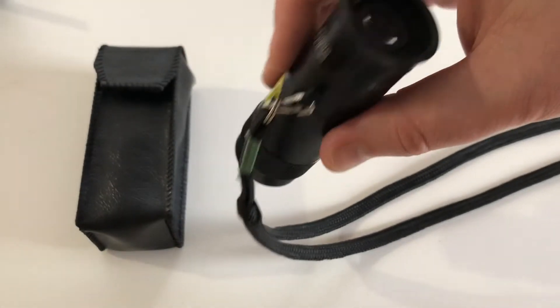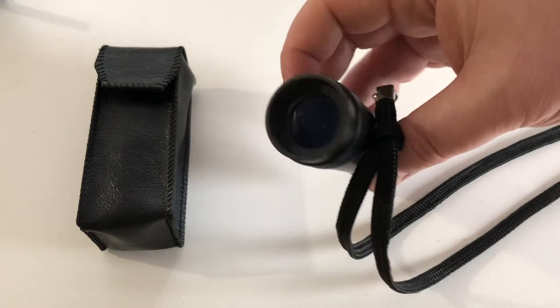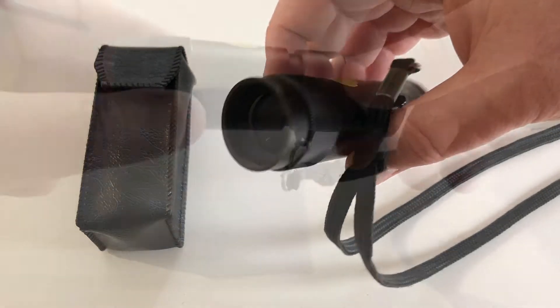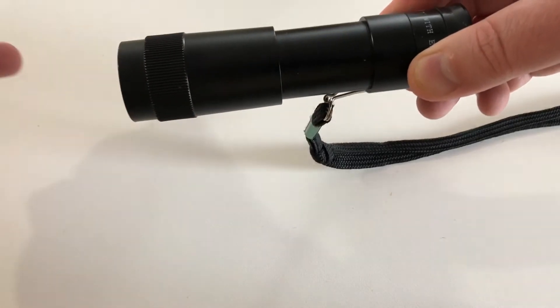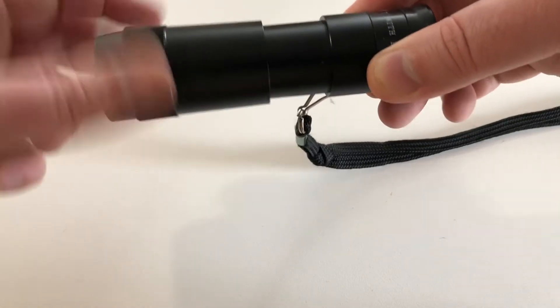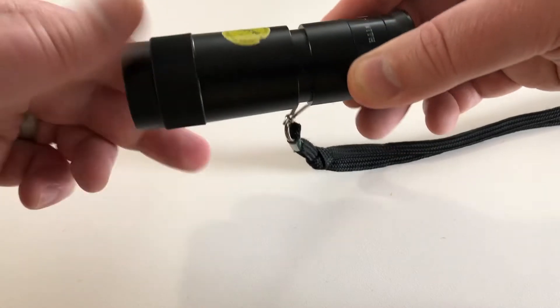Monocular telescopes are used to view distant objects up close, and this one actually has a feature where it can view targets at near as well. If you extend the telescope out, it'll focus up close, and as you tighten it in, it will focus on targets far away.